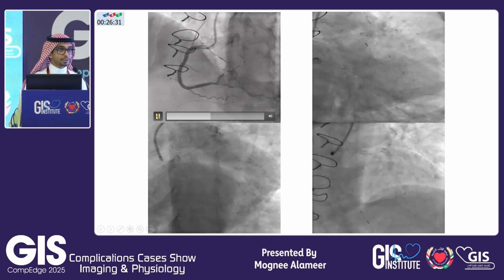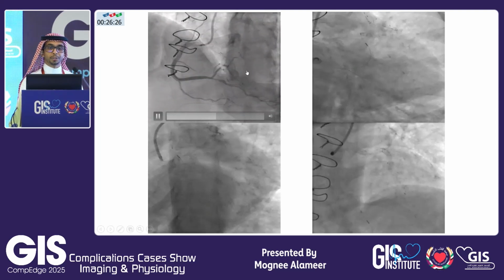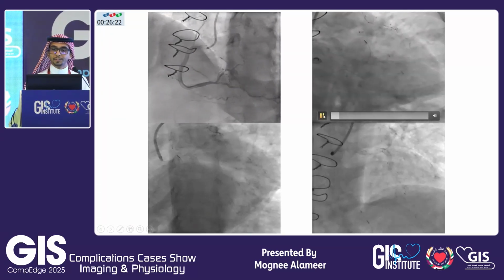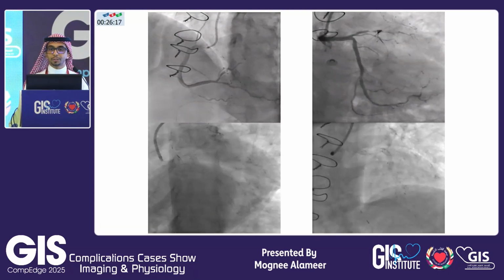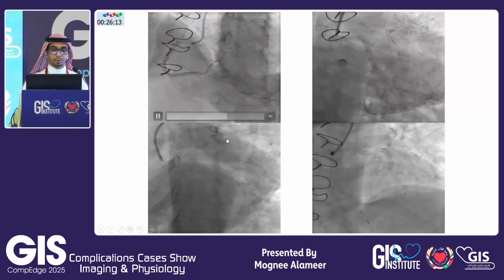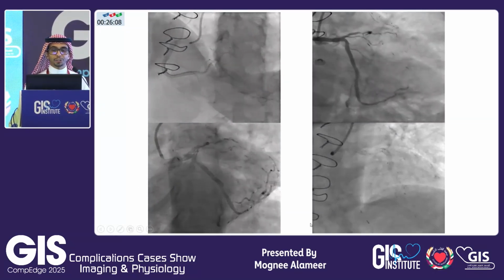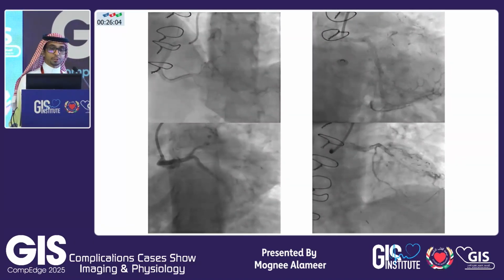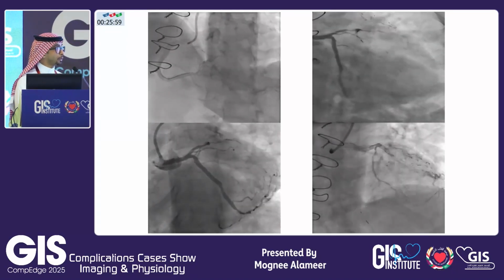This is the right system, almost the same as 1 week ago, except for the ostial circ, as we know that it's tight from the beginning. The left system, TIMI 3 flow, stent on the ostial left main circ, looks okay. And even another projection for the left system. Do you notice anything here? Do we need to do something, or that's it? Just we have to end.